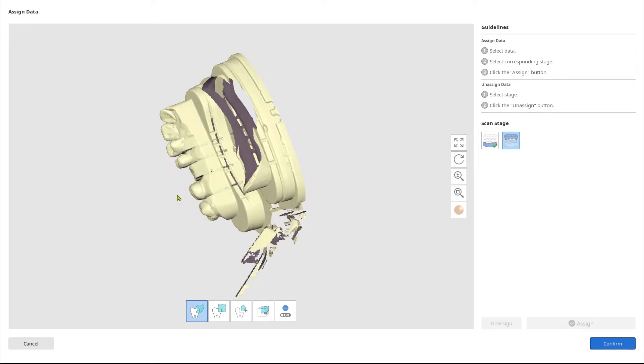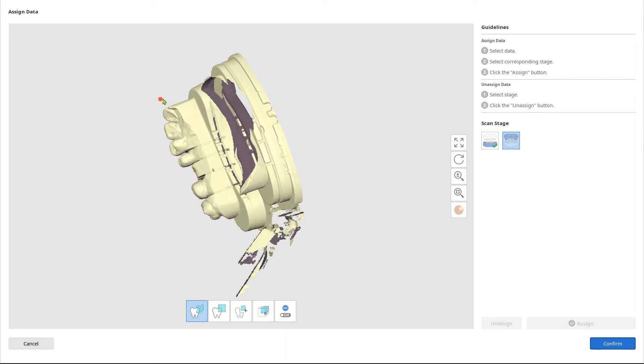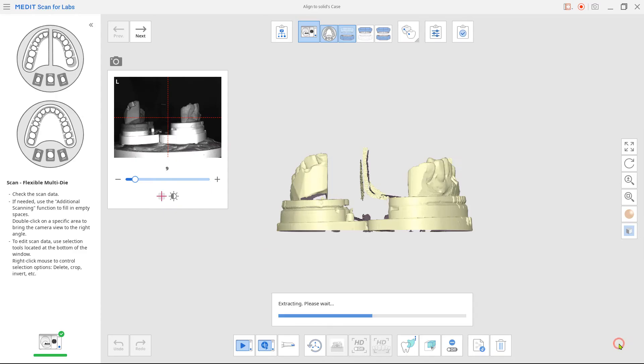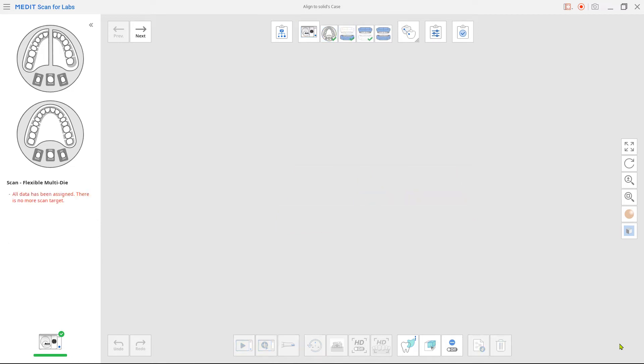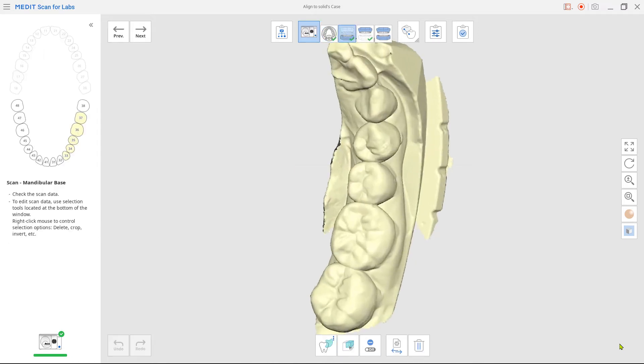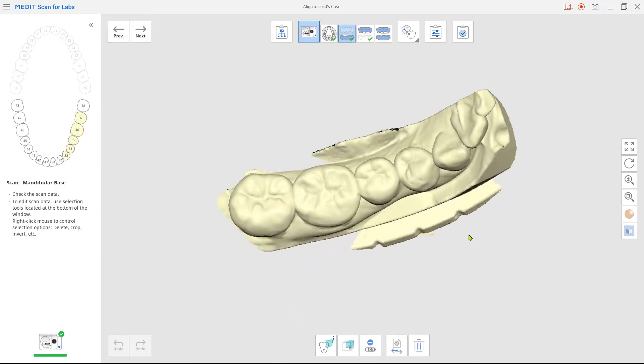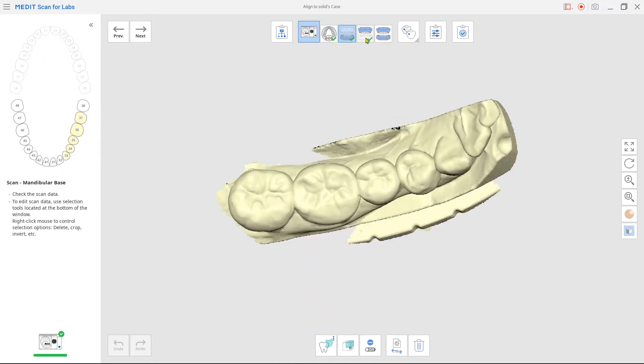Next, do the same for the maxilla. Now you have both scanned and assigned upper and lower data.